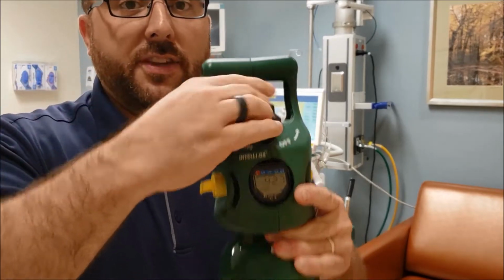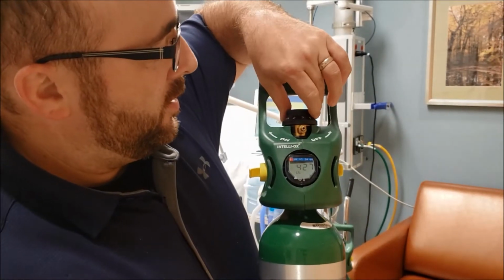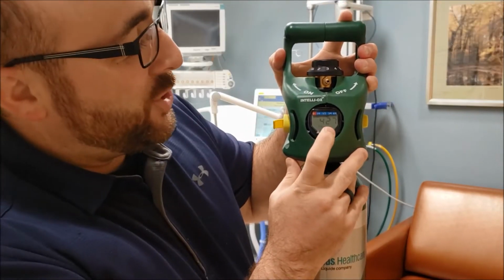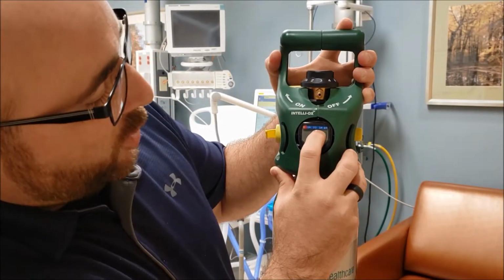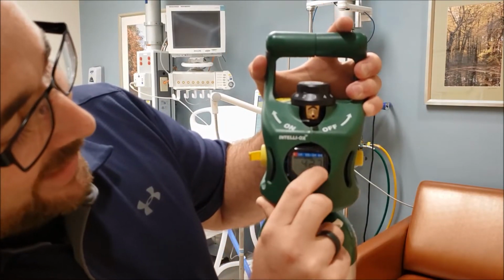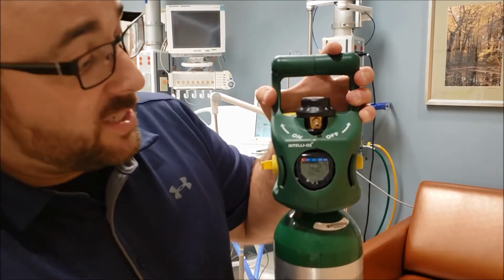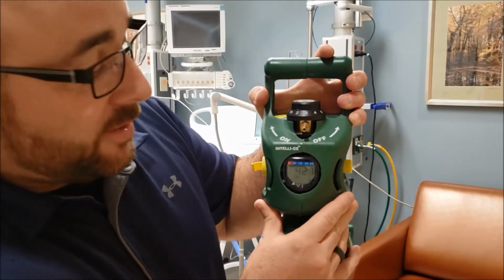The difference is that when you turn the flow on, let's say in this case it's 3 liters, it's going to calculate the duration left in your tank. You're going to see here right now, this is about just under 3/4 of a tank. You can see by that reading right there, this has 427 liters left inside the tank. So it's not measured in pressure per square inch, it's measured in liters. So a full tank is about 600 liters.